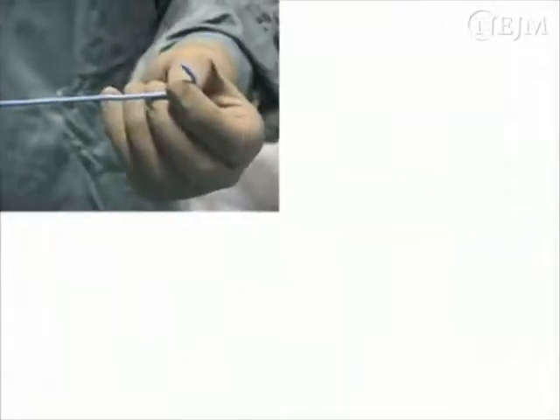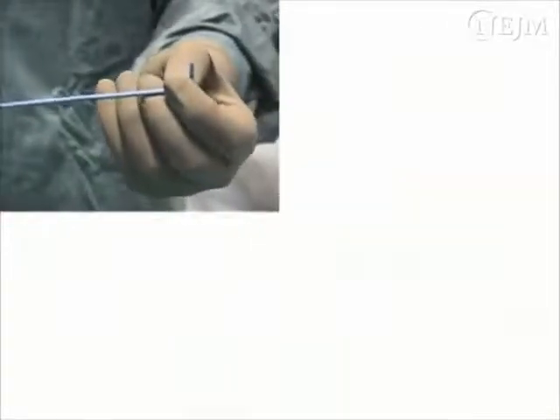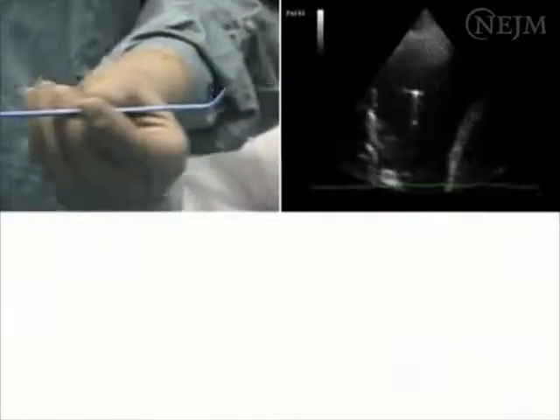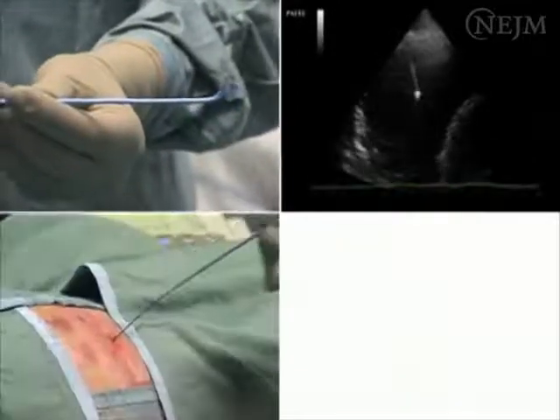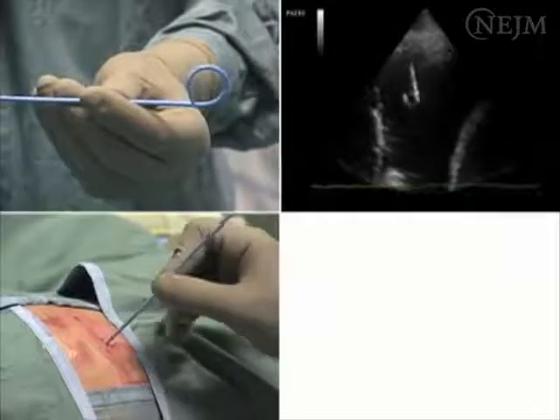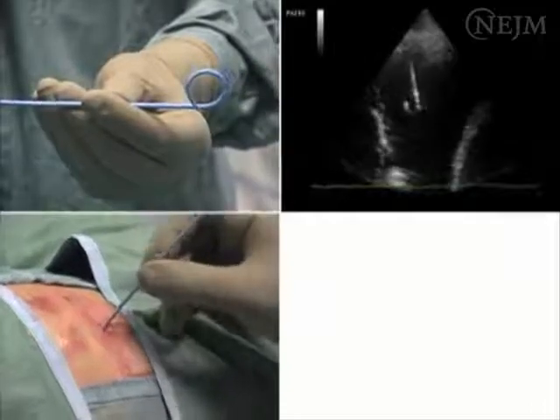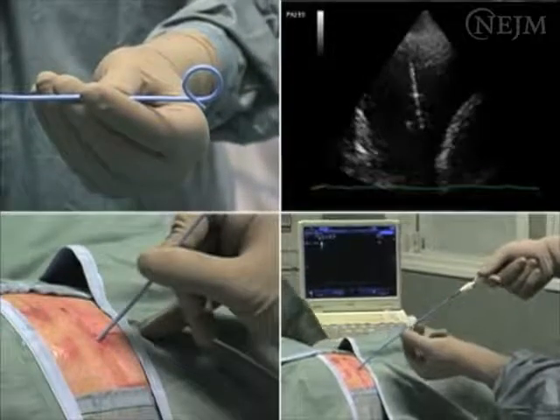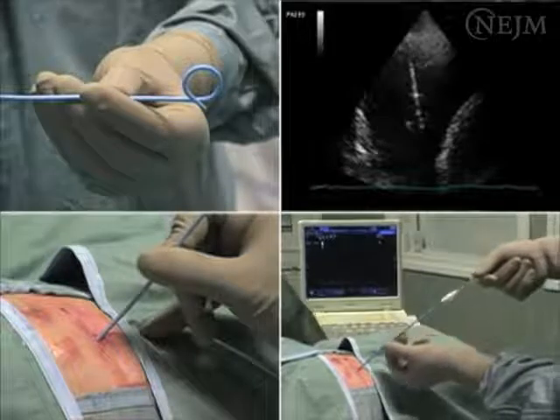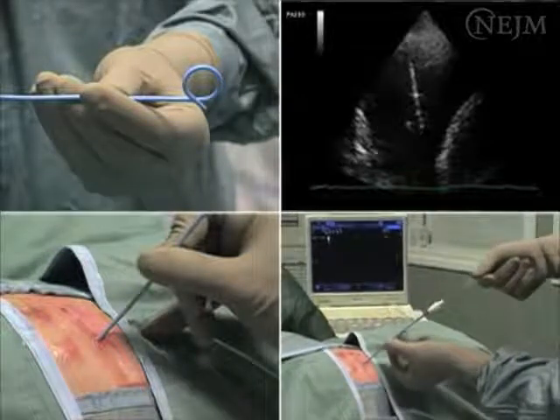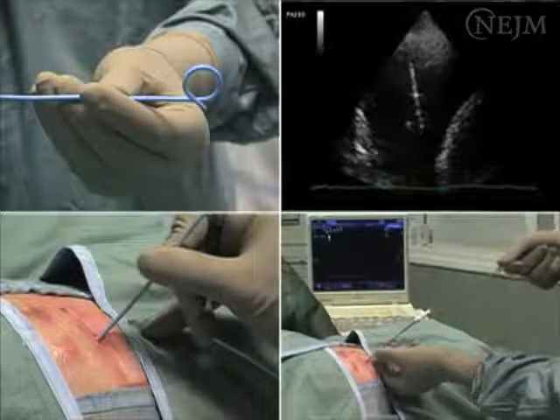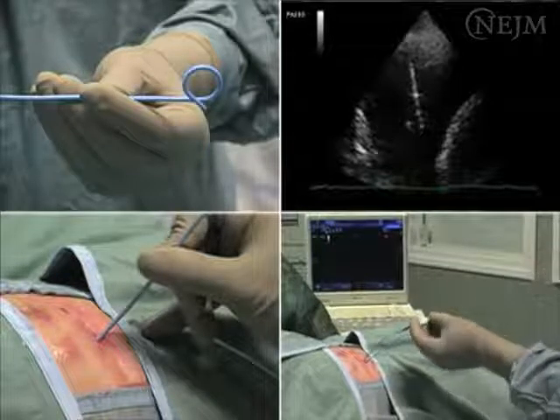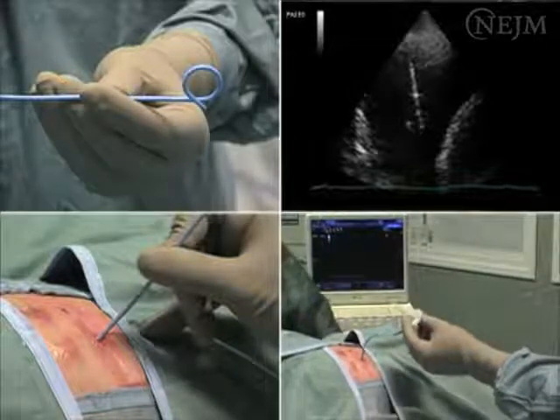Ultrasound guidance is currently considered to be the safest means of positioning a pleural catheter and draining a pleural effusion. This technique requires the development of skill in the use of ultrasonography and in catheter placement. Careful selection of patients for whom the procedure is appropriate, the presence of an experienced operator, and access to a detailed clinical protocol can minimize complications.